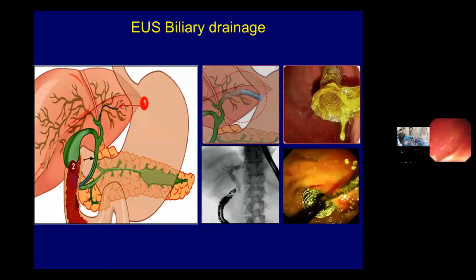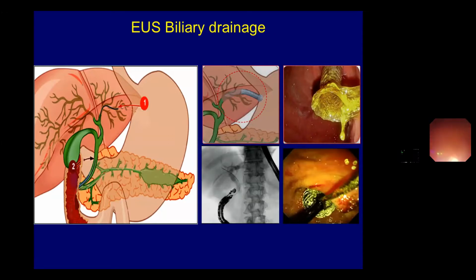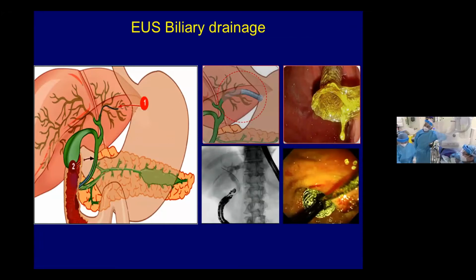And now again, coming finally to an area which I think is going to overtake all other areas of endoscopy, the endoscopic ultrasound. In fact, this forum is basically experts of EUS meeting. I was very skeptical about how EUS would take off. In fact, I'd argue with Shyam many times about its use, but I keep realizing now as progress is occurring that EUS is really going to replace many areas of ERCP-related work. EUS biliary drainage can become in future one of the main methods, bypassing ERCP, and could become the primary method of how we drain the bile ducts.